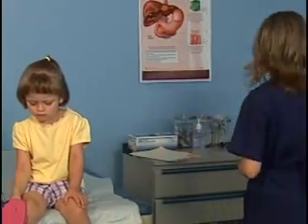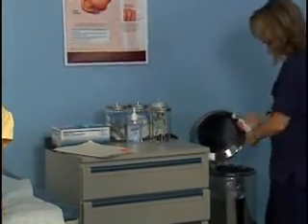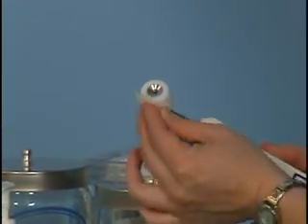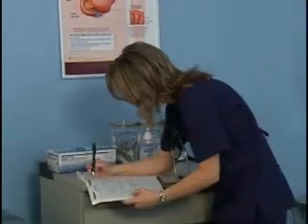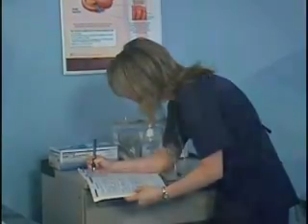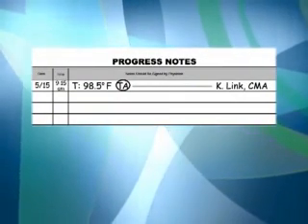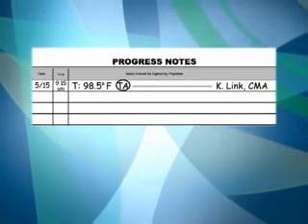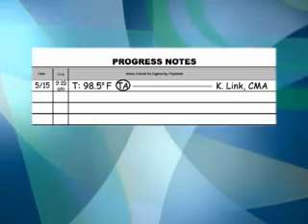Dispose of the probe cover by pushing it off the probe with your thumb and ejecting it into a regular waste container. Wipe the probe with an antiseptic wipe and allow it to dry. Sanitize your hands and chart your results. Include the date, time, and temperature reading. Note that the temperature was taken at the temporal artery by writing the symbol TA next to the reading. This tells the physician that this is a temporal artery temperature.